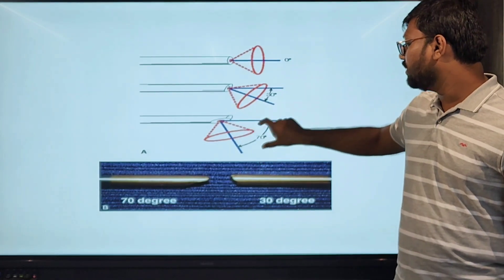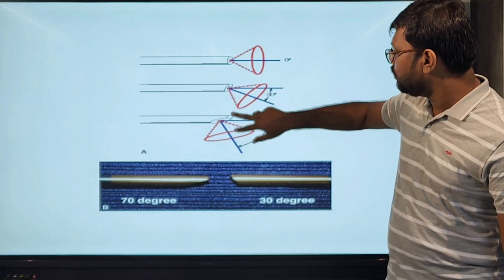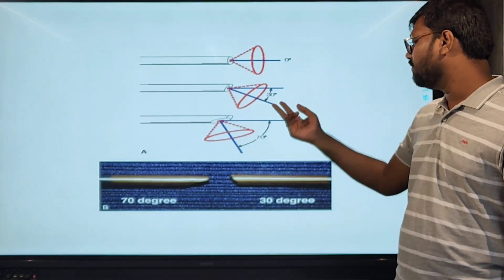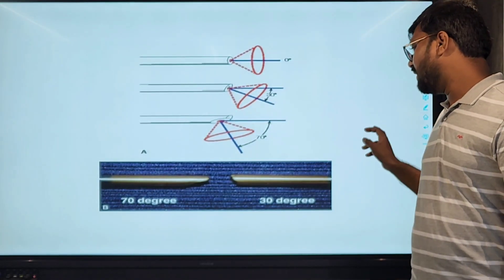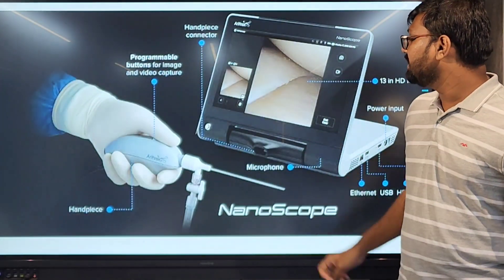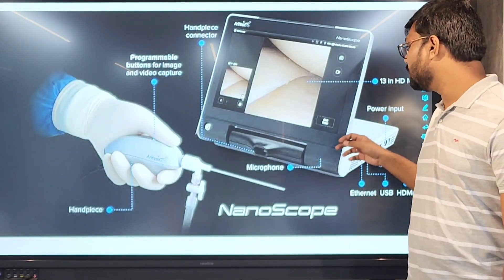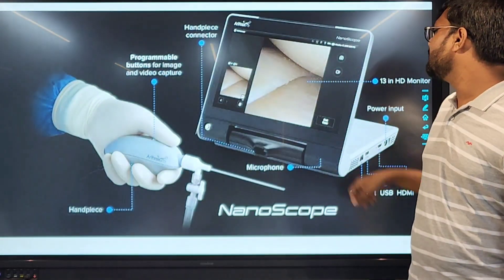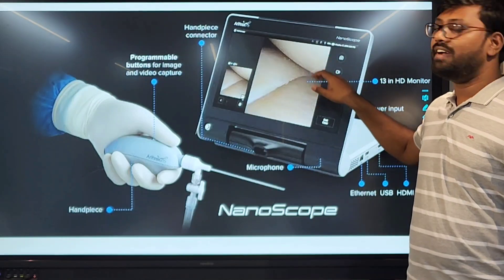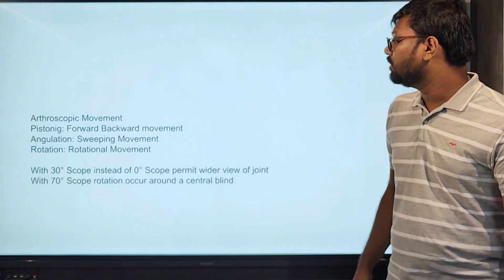This is a 70-degree arthroscope — we have a center blind spot around which we can use the field of vision through that part of the lens. This shows a 70-degree and 30-degree arthroscope together. A recent advance is the nanoscope, which can be used in OPD procedures, and it has a square view portal, unlike the circular portals of traditional scopes.